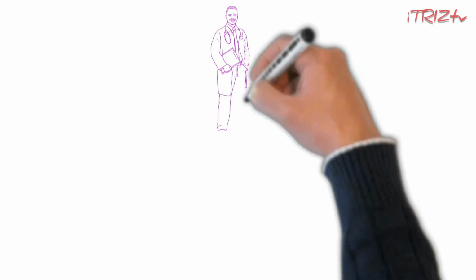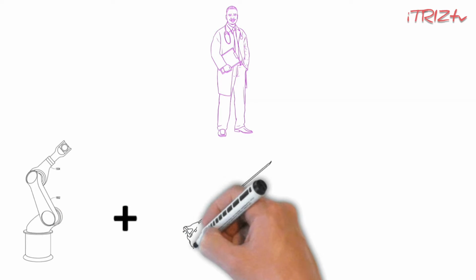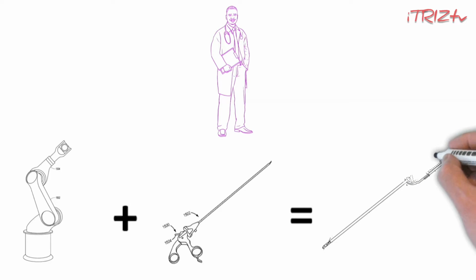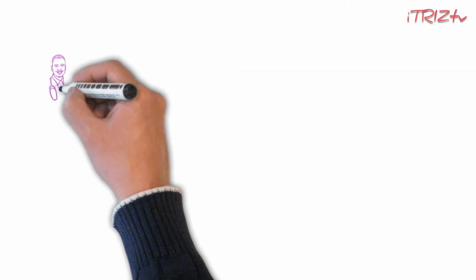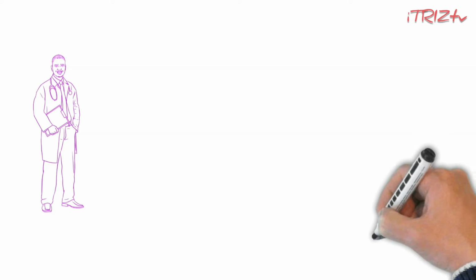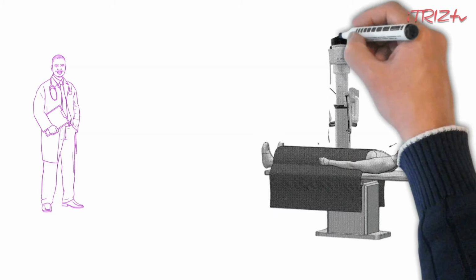In order to carry out surgical operations by robot, they crossed manual surgical instruments with robot hands. So now these instruments can have very fine movements and can be utilized for robotic surgeries. Instead of just two hands, as in humans, a surgical robot can have many hands. For example, the Da Vinci robotic surgical system usually has 4 hands. And special surgical tools needed for particular operations are installed on the robotic hands.